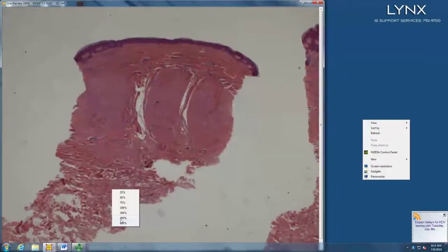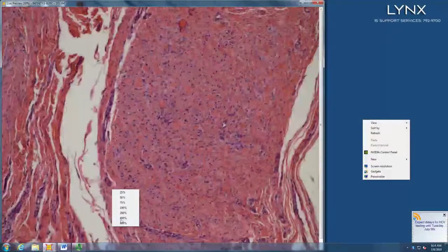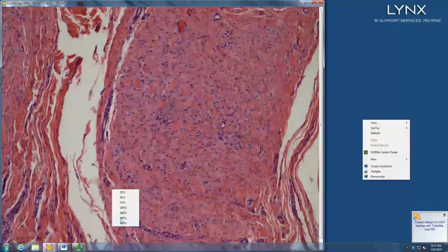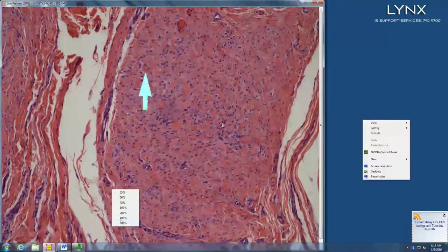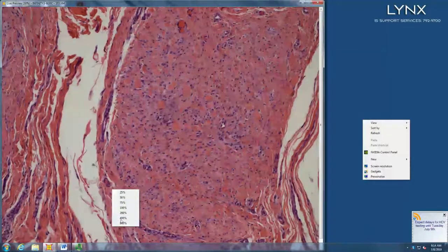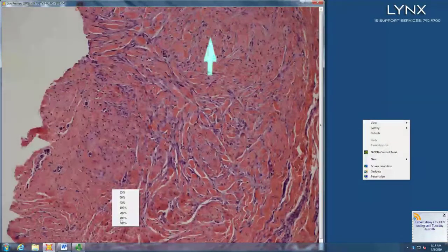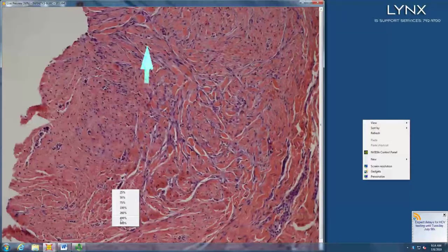Punch biopsy, do you have nodules in your dermis? They look like... and it's starting to form that and that and that. Oh, I guess it's like whorls of collagen. Yeah, so there are whorls of fibroblasts and they're starting to form this bubblegum pink. Looks like Bazooka bubblegum to me. So this is keloid. Yep.